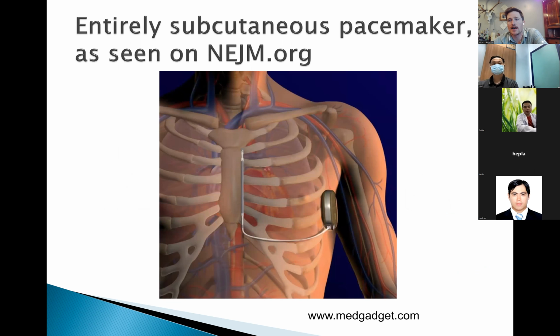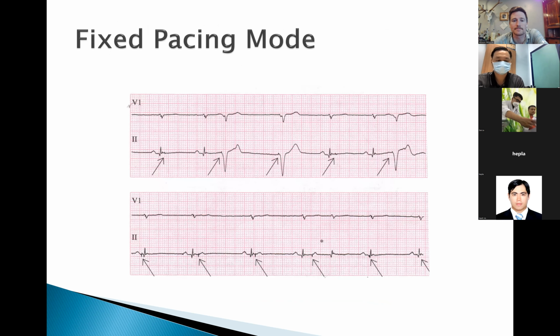There are some pacemakers that are entirely subcutaneous. I've never seen them. That means the wires and everything are subcutaneous as well. These, I think, have more problems with failure to sense and capture since it's not directly in contact with the myocardium. But theoretically, they would maybe have less risk of a wire misplacement or perforation of the myocardium since it's all subcutaneous.